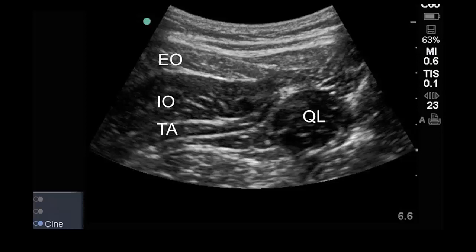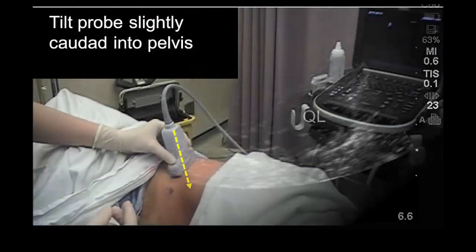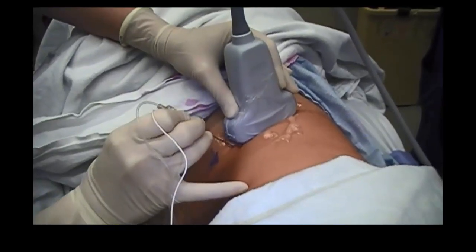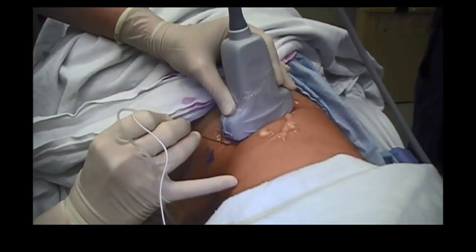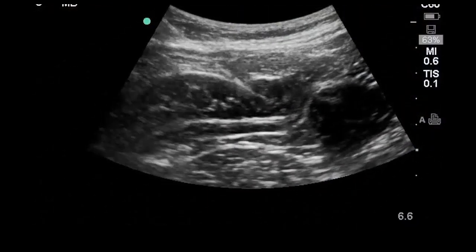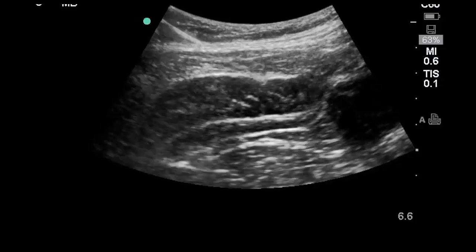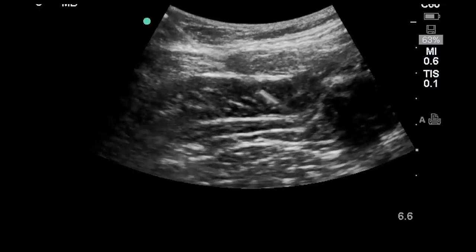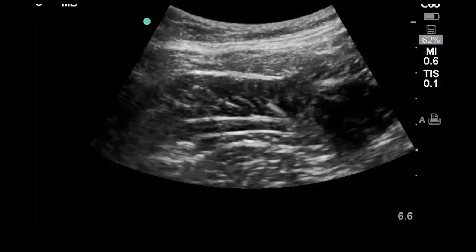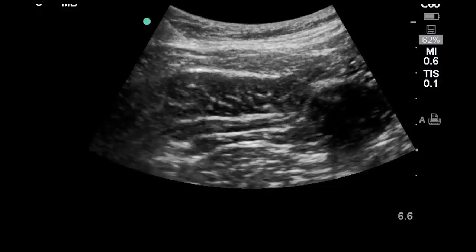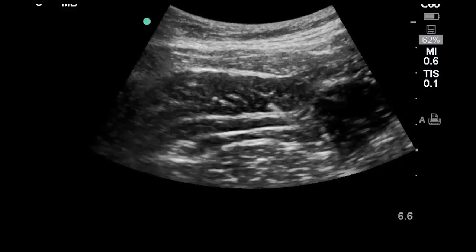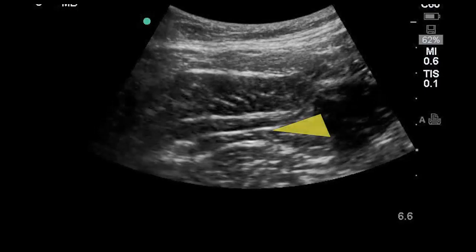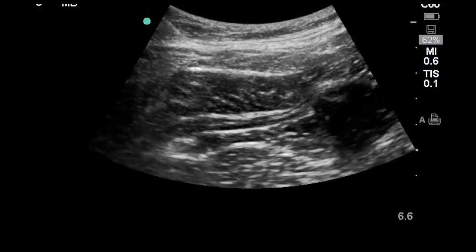The quadratus lumborum is often, but not always, visible just posterior to this taper. Tilting the probe slightly caudad into the pelvis often improves the view of the tapered end of transversus abdominis. An 80 mm block needle is inserted in-plane to the probe in an anterior-to-posterior direction; an echogenic needle is useful given the relatively steep angle and depth. The needle is advanced through external oblique and internal oblique, aiming for the tapered tip of transversus abdominis. Once the needle tip has pierced the deep fascia of transversus abdominis, a test injection is performed. Correct needle tip position is signaled by a pocket of local anesthetic between the deep fascia of transversus abdominis and the transversalis fascia.